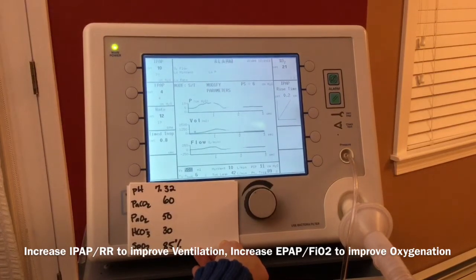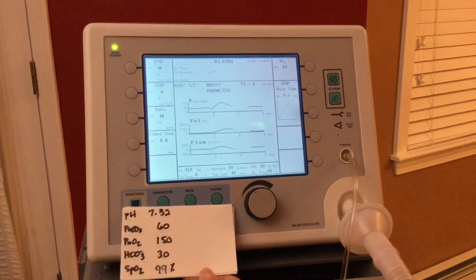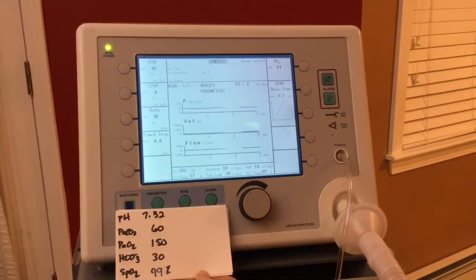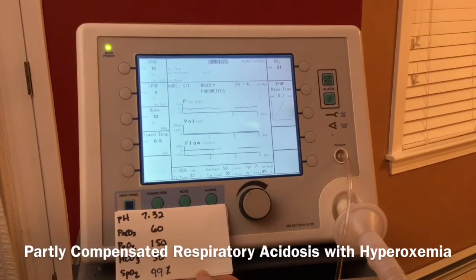Let's try another blood gas. Interpret the blood gas. If you interpreted the blood gas as partially compensated respiratory acidosis with hyperoxemia, you were correct.